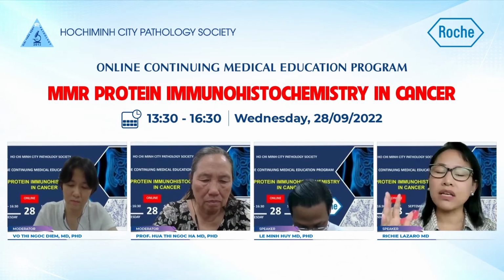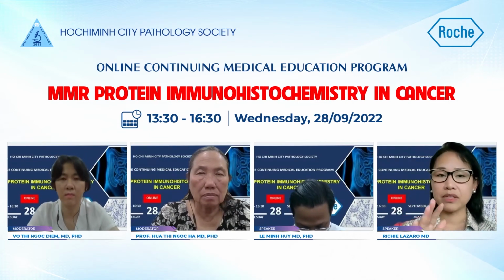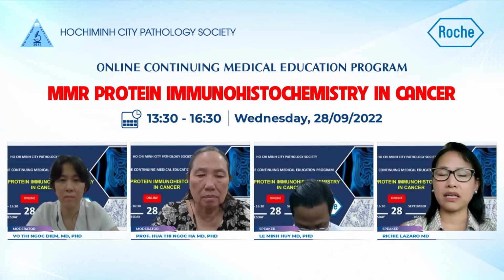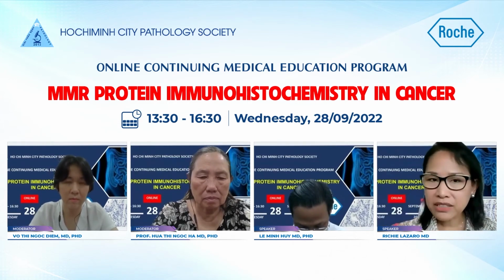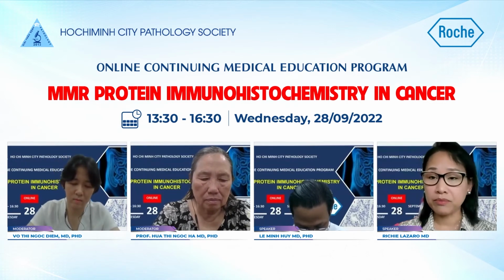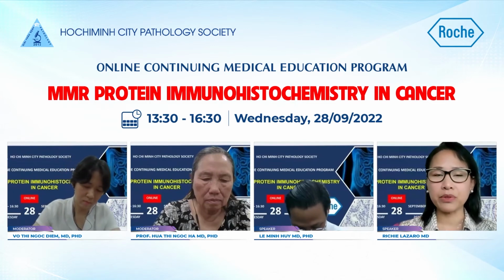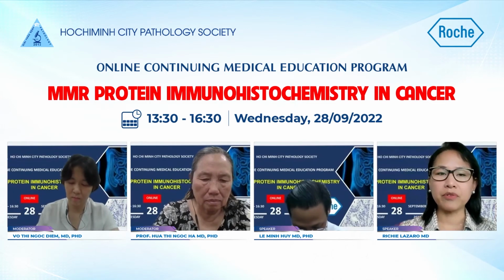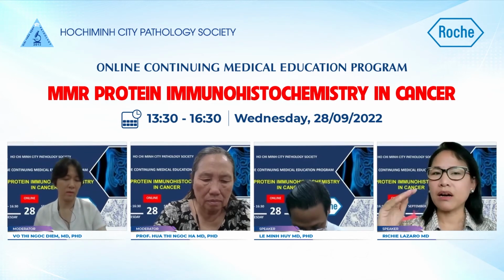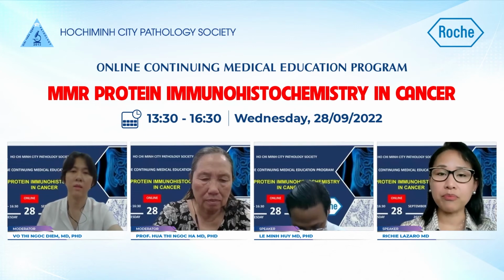Same with the scenario where it is less intense staining, like weakly staining, but diffuse. Depends on how the weak staining looks under the microscope. If it is really weak, like as shown in my example in my lecture, very focal, very patchy, weak, I would call it loss of protein expression.